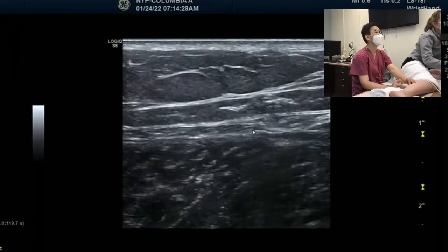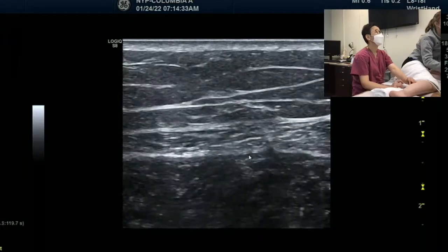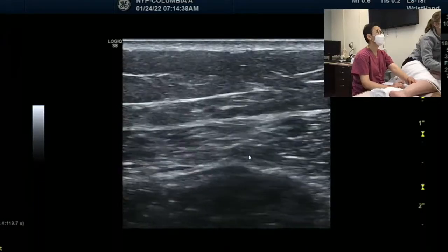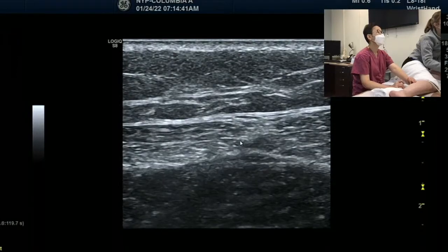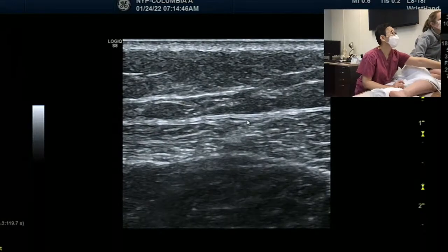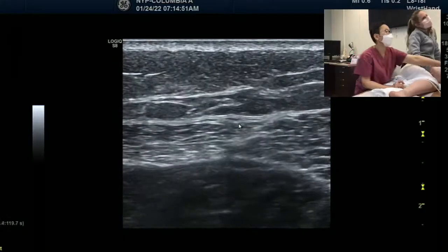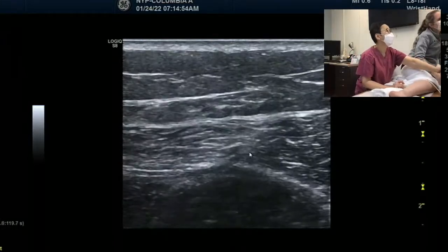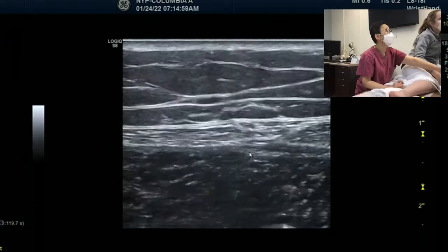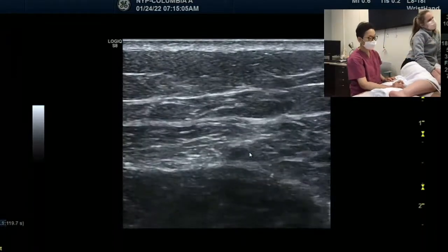It was very hard for us to track down. It's splitting now, which we didn't know which one we were going to follow. It becomes very small. Still I only see one now, here in the middle. No, above. Underneath. Here. The funny thing is you have to go up and down. Move the cursor, right? See? The nerve is there. That one there goes down over there. Going down.